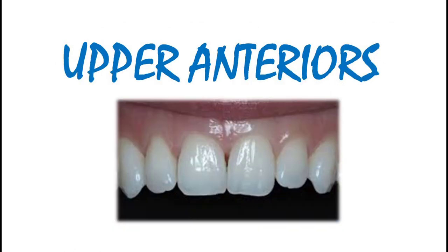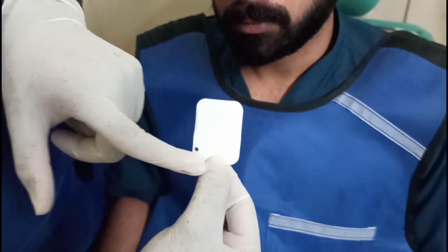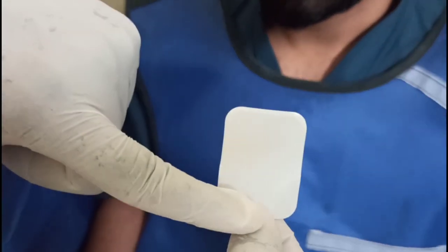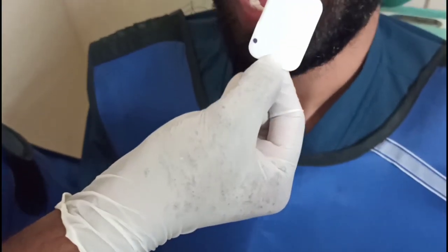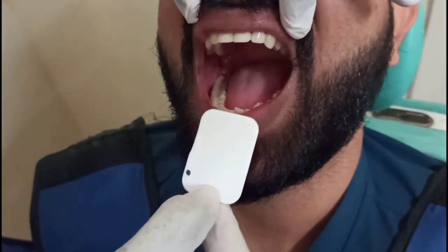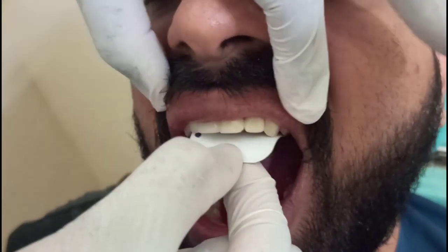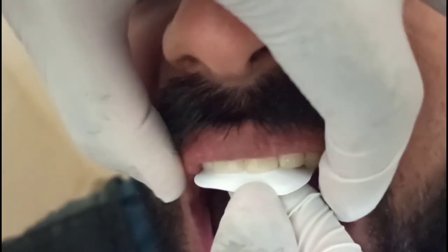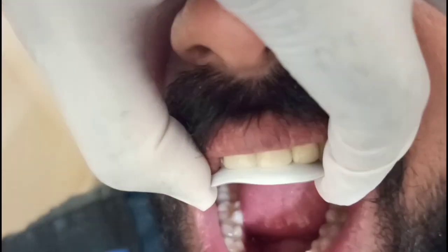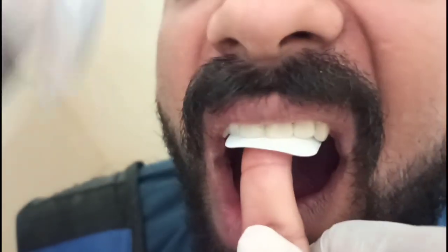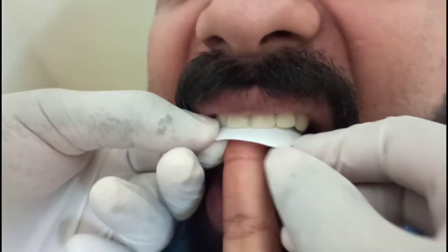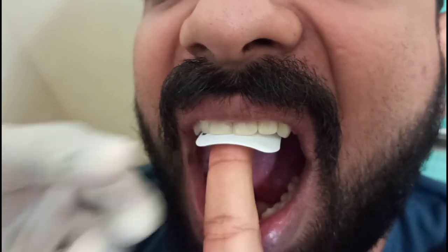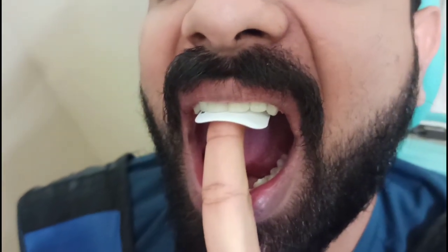Placing the film for upper anteriors: measure how much you want the edge to extend away from the incisal plane and keep that measurement with your thumb finger. Now take it inside the mouth and hit your thumbnail to the incisal plane, making sure the edge of the film is parallel to the incisal plane. If you want to adjust the film, ask the patient to remove his fingers, then adjust it, and put the fingers back.